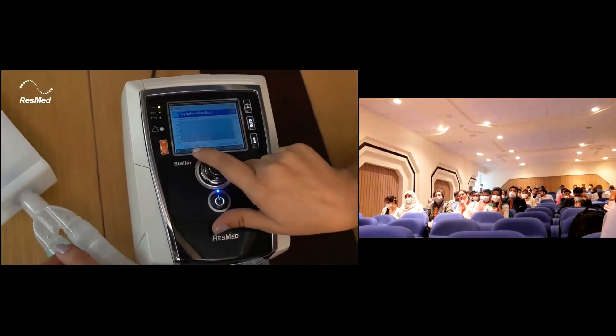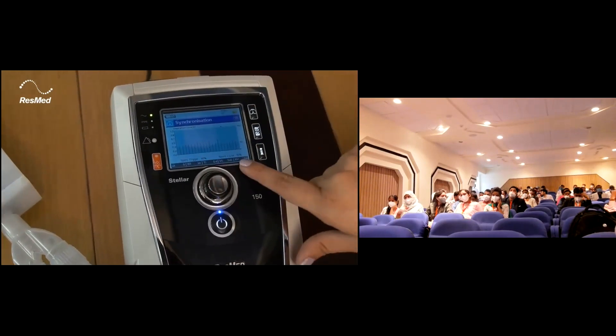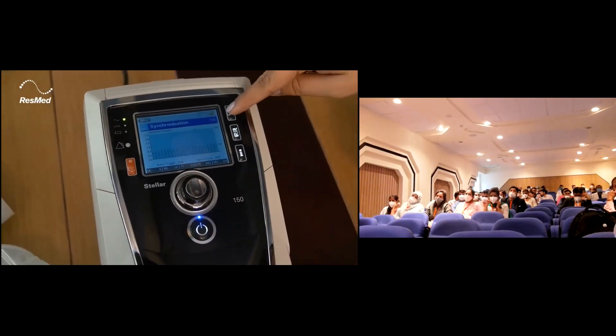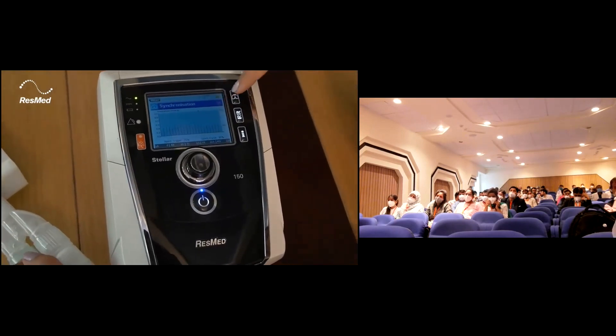The yellow color triangle basically means the breath was ended by the device. There was no spontaneous triggering in this breath and no spontaneous cycling in this breath. You can see the spontaneous triggering percentage and spontaneous cycle percentage, which are important parameters for clinical decisions.